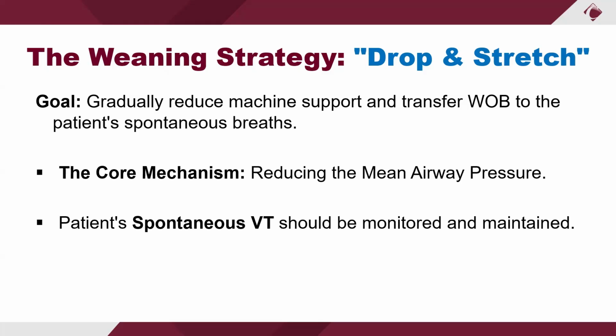Again, you're going to go back to that. Remember that picture, the person just laying there flat, air in and air out? That is not enough pressure or mean to hold or retain that FRC. And this method is the only way you'll be able to do it all the way down to CPAP. Because remember, that's all we're using here is just straight CPAP.